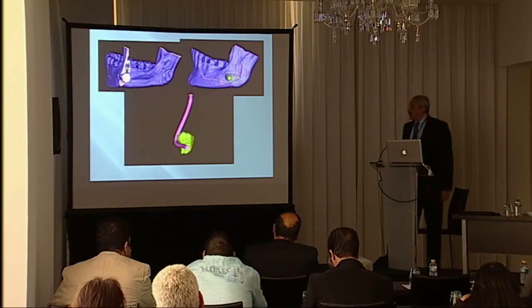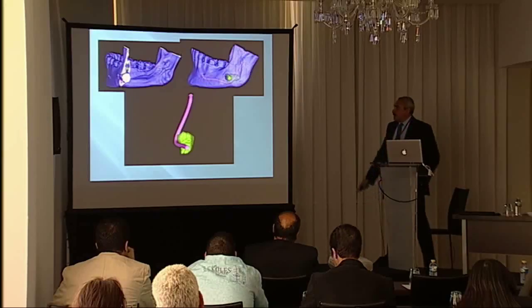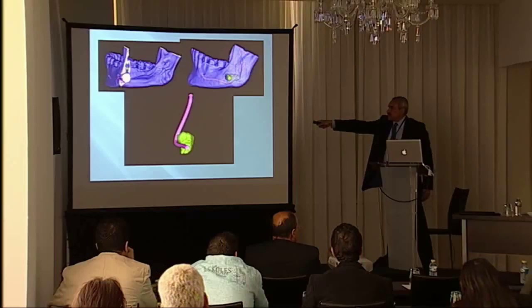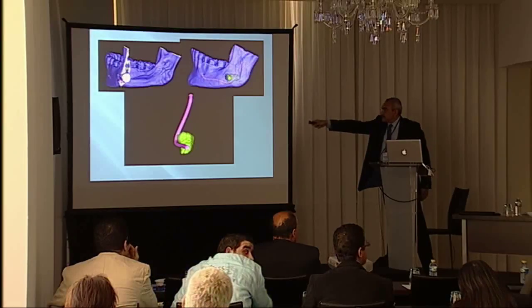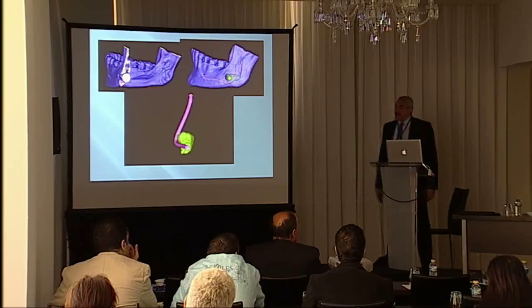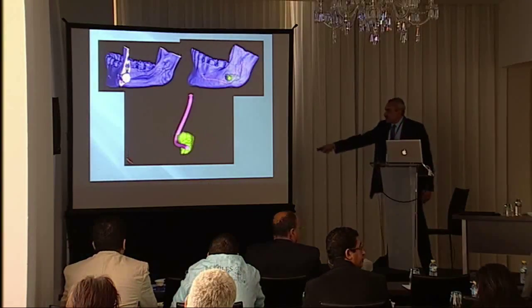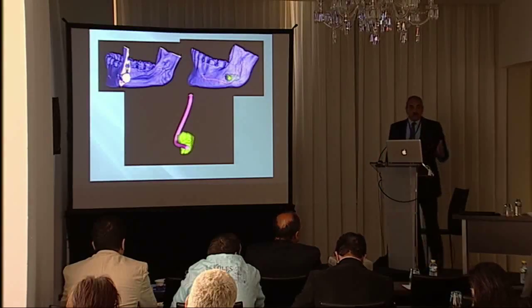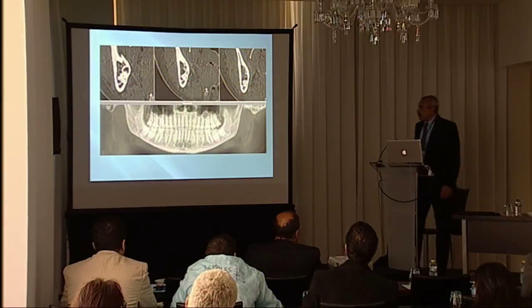But when you do that using 3D modeling, you can actually see the tooth. This is a cut section. We can see the tooth. We can see the space for the cystic lesion, and we can see the inferior alveolar nerve, and we can take everything out and check the relation of the tooth and nerve alone to decide where to go, from where to reach and access the tooth, and where to put your tooth sectioning.